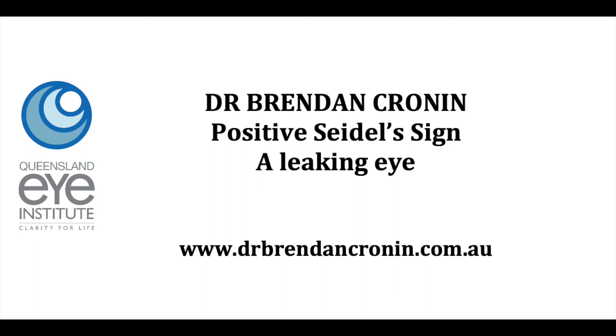This is just a quick video to demonstrate a positive Seidel sign, also known as the waterfall sign.